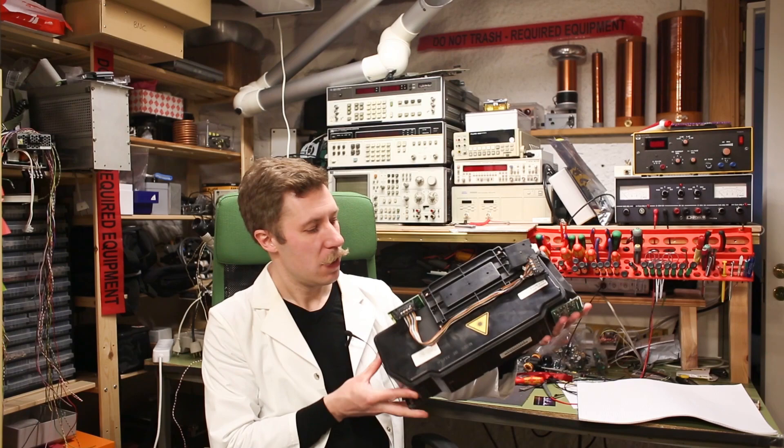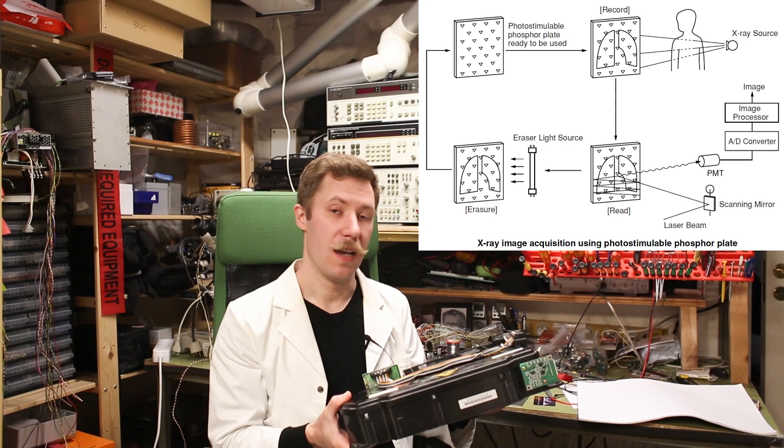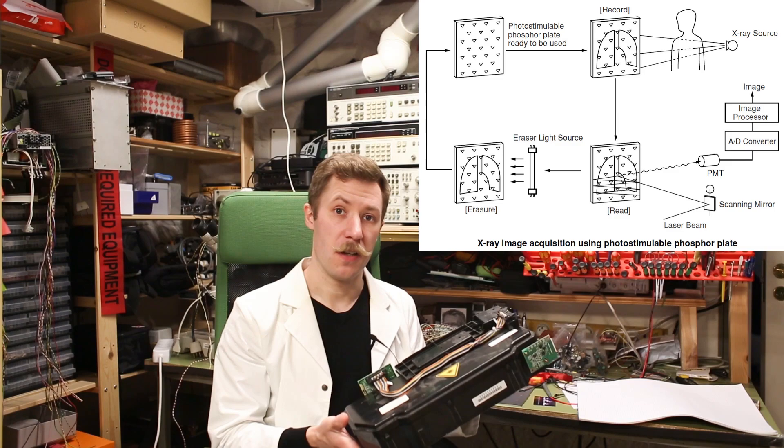Hi, all. My name is Mads Bartenkopp from Kaiser Power Electronics. This is part two of the Fujifilm X-Ray Image Scanner. Today, we're taking a look at the laser module. The laser scanning module produces the line-scanning beam that is used to illuminate the image plate and read out the resulting light brightness from the exposed image plate and convert that into a digital image.